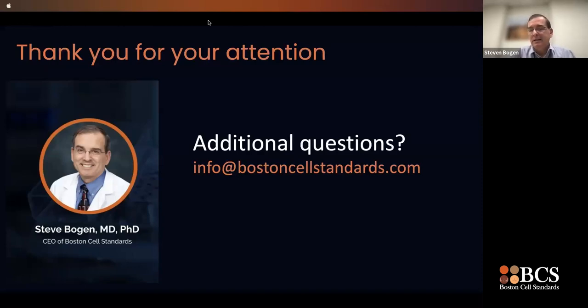The NTRK data were also very big news, particularly because the labs that were using the off-the-shelf assay, the one that's ready to use, were dramatically insensitive, missing almost half the cases of patients who were eligible for Vitrakvi treatment. And again, the labs that got it right were using laboratory developed tests.